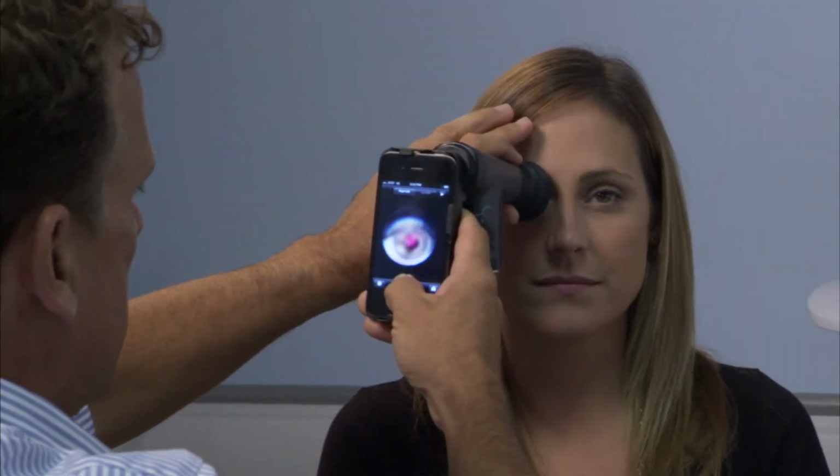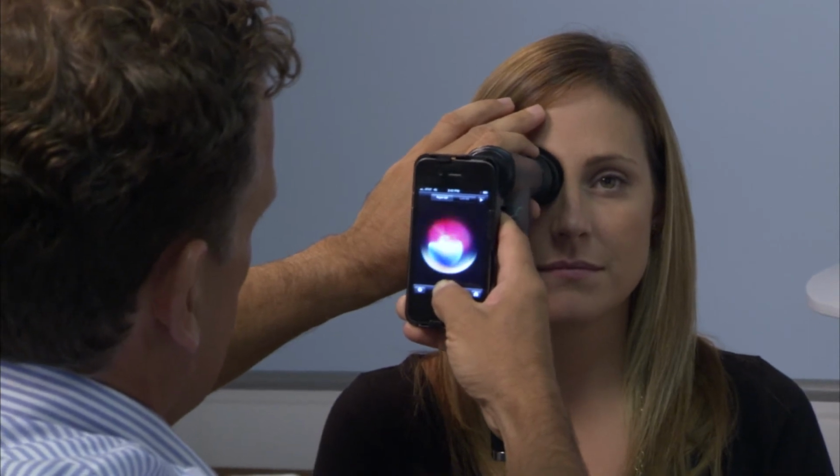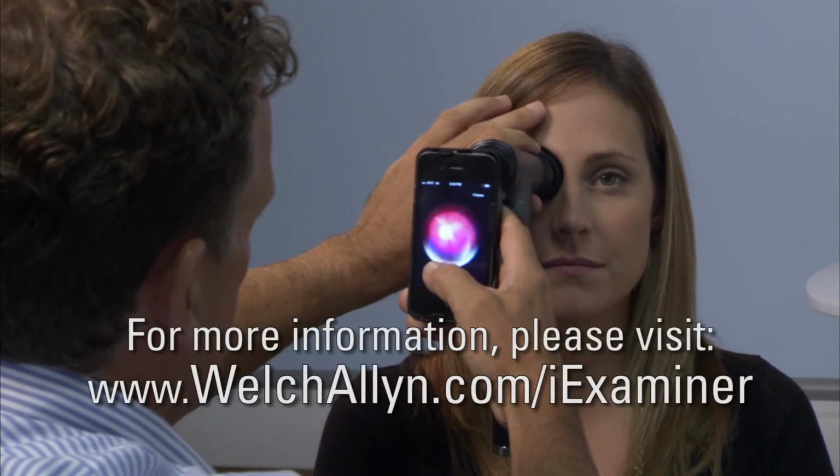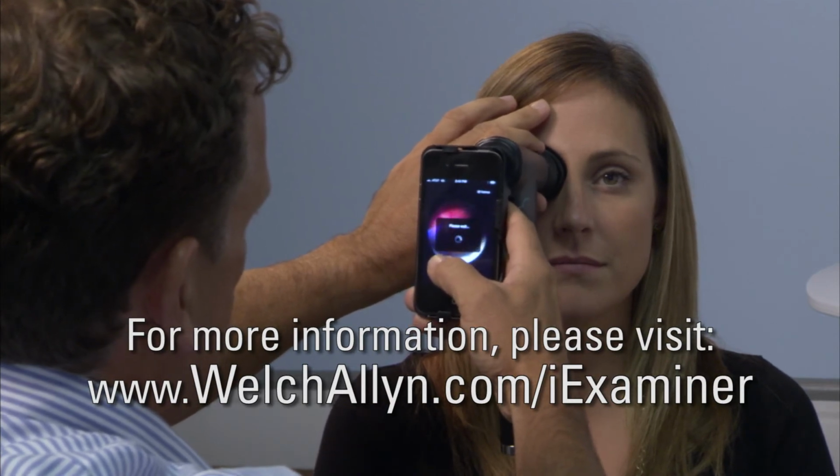Remember that practice is the key to becoming proficient. With frequent use and repetition, you'll experience a rapid learning curve. Over time, we are confident the iExaminer will become one of your most powerful diagnostic tools.